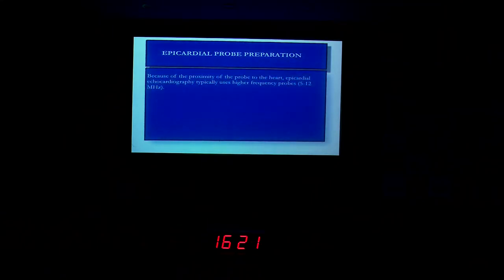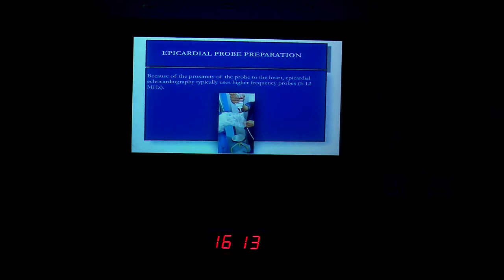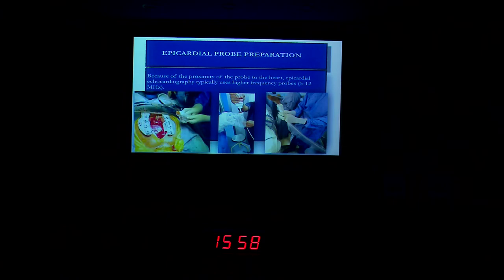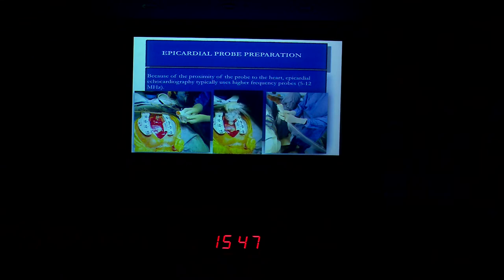Epicardial probe preparation is very important. We use a high-frequency probe because we are directly touching the patient's heart. We apply jelly on the probe and then cover it with a sterile sleeve. We use probes of 5 MHz frequency and above. We must insert the sleeve in such a way that no air bubbles are entrapped near the probe. If required, we can put saline into the pericardial field to allow better propagation of the ultrasound signals.